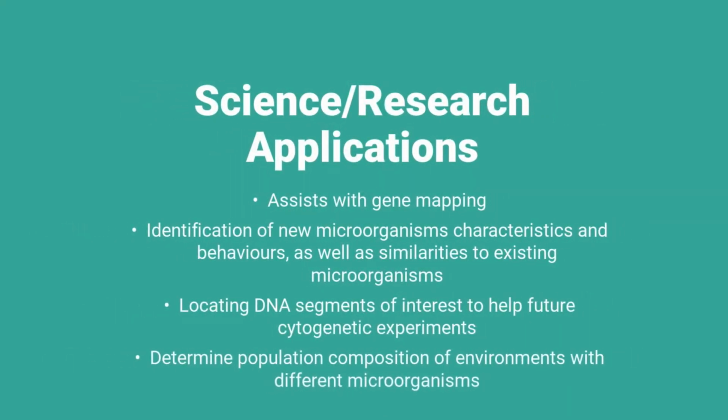Science applications of the FISH procedure include using it to identify new microorganisms, especially pathogens, and comparing the DNA segments of new microorganisms to existing organisms to search for similarities in genetic code. This allows for a more detailed estimation of how a new microorganism might behave. FISH can also be used to determine the population composition of environments with multiple microorganisms, as DNA segments unique to particular microorganisms can be used to show their location.